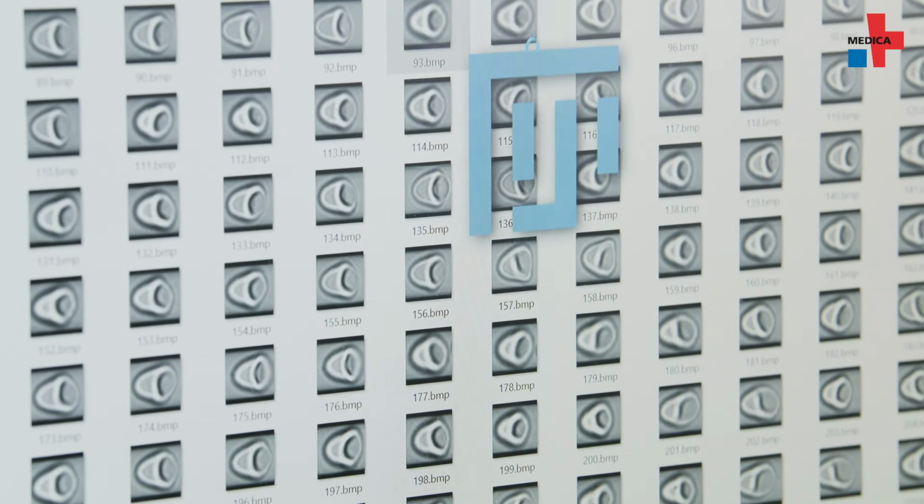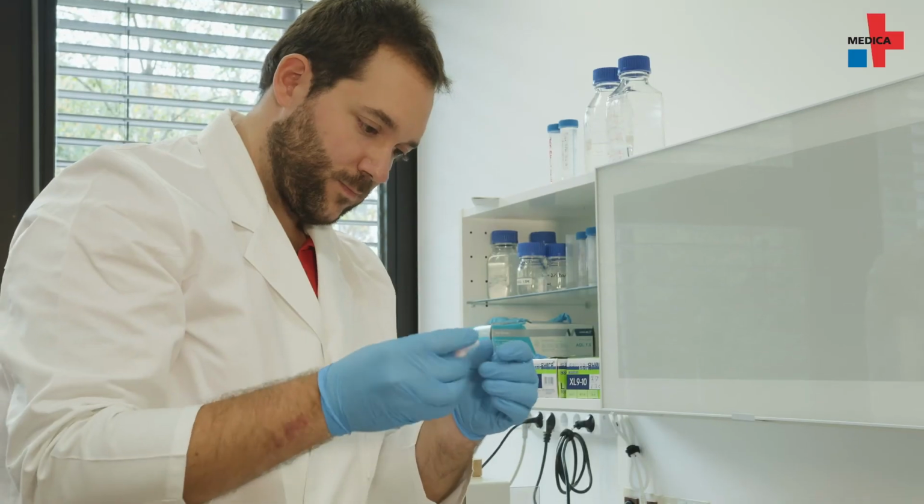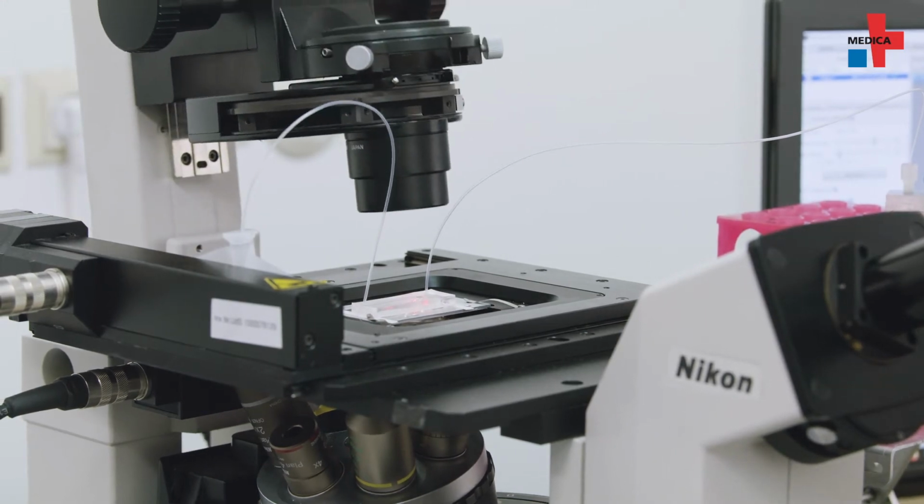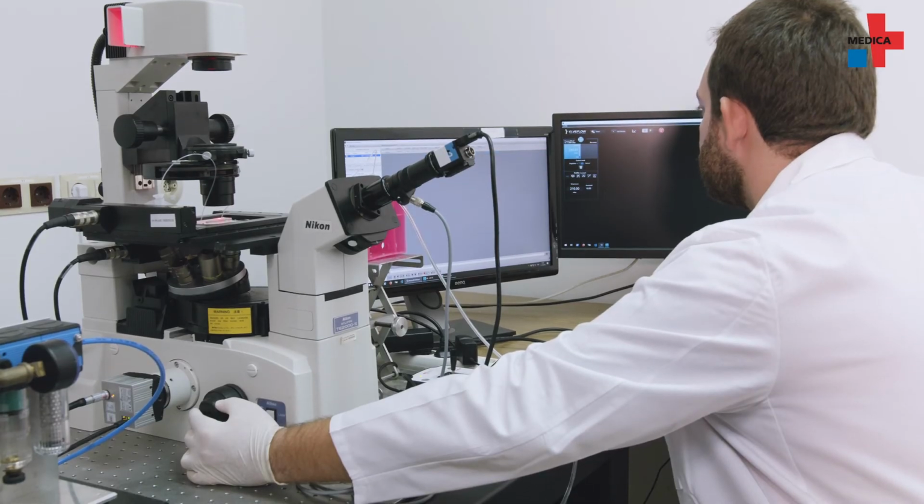The benefits of classifying by using artificial intelligence are obvious because you eliminate human error and make the classification objective. Another advantage is the fact that, unlike humans, the network can process larger volumes of data within a specific time frame. The classification of cells into different classes is based on their shape. Thanks to the software, the scientists can instantly detect any changes.